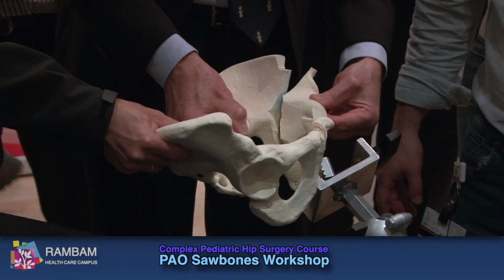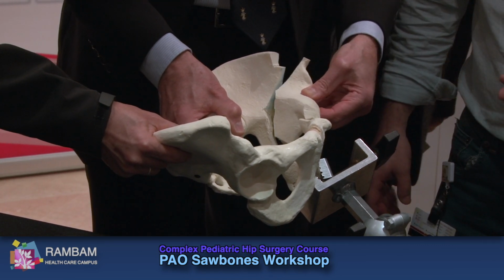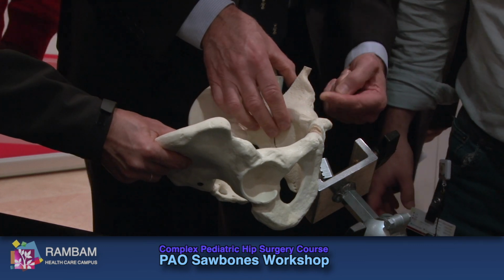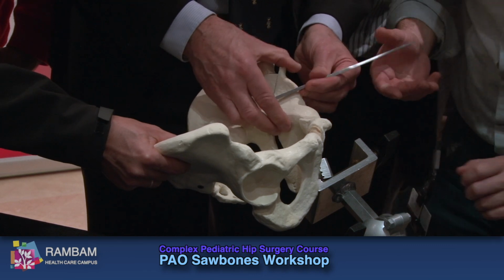Right? We're going to medialize it. And we'll rotate it in like that. Show the screws going from here up towards the corner there. Like that.